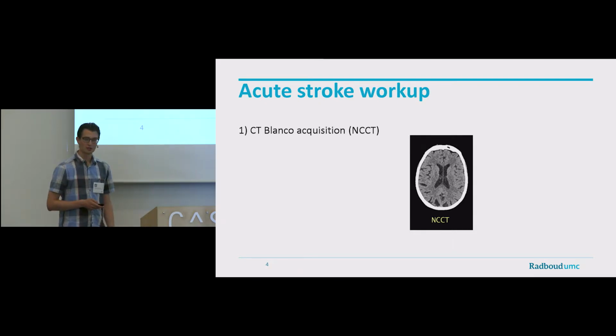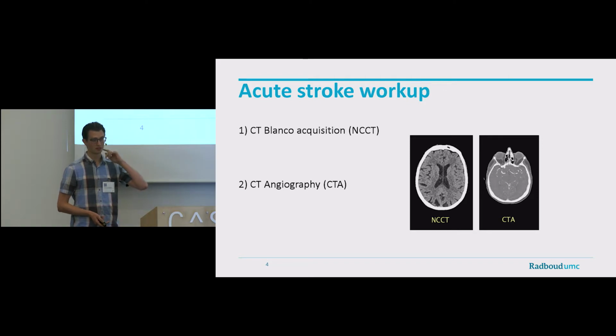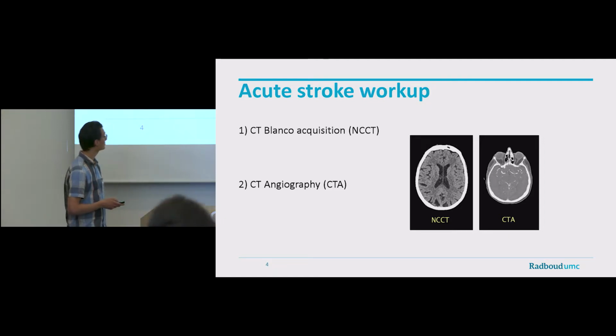But if this is not the case, then there could still be suspicion of ischemia. Then you want to take an additional scan. They inject contrast liquids inside the arteries, and this will disperse through the brain. While it disperses, another three-dimensional shot is being taken, and the vessels will really highlight on this image. So you can identify which vessels are not really reached.